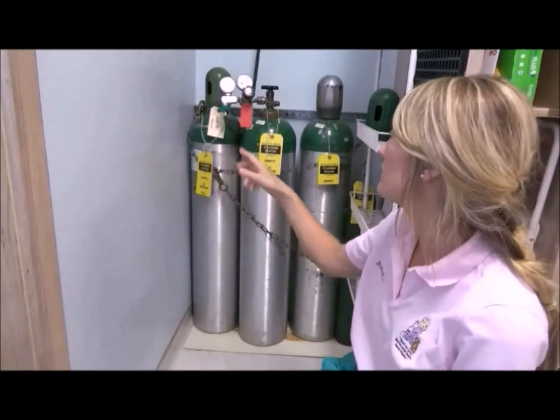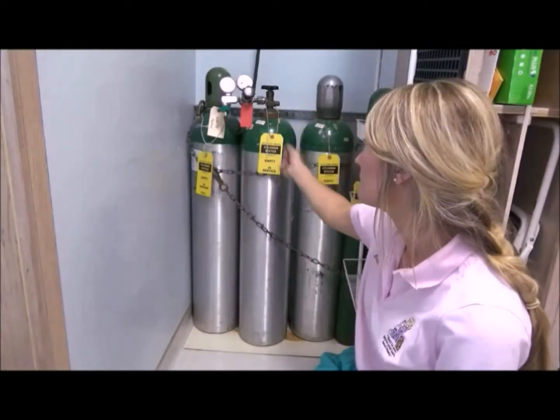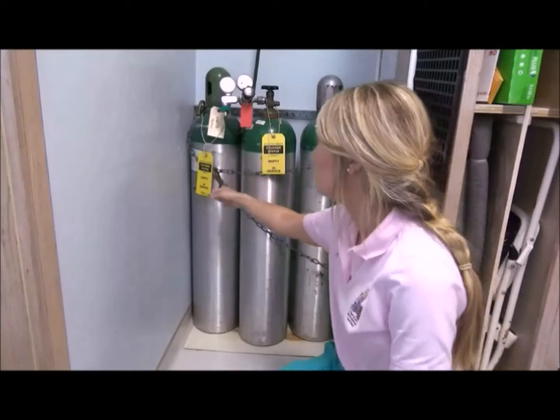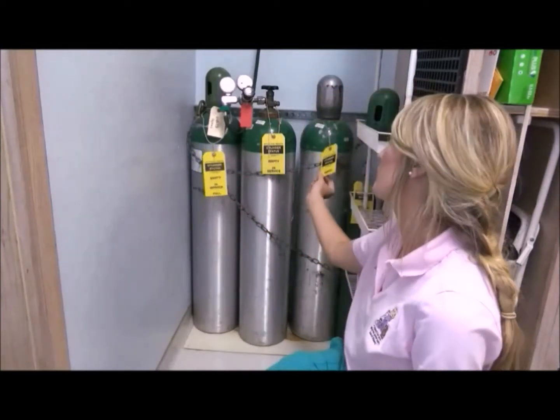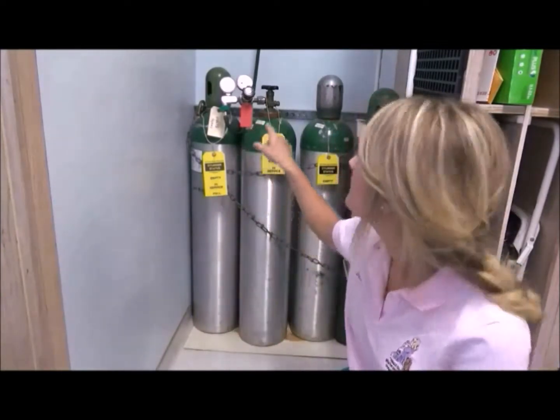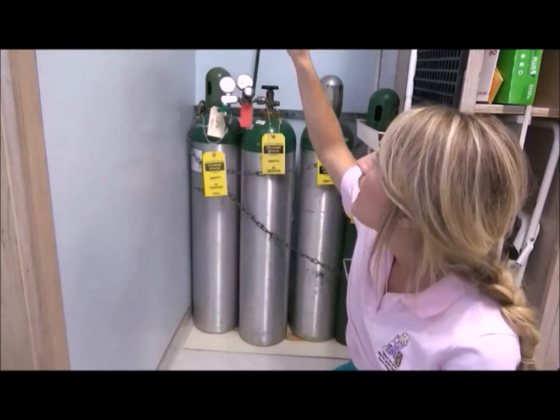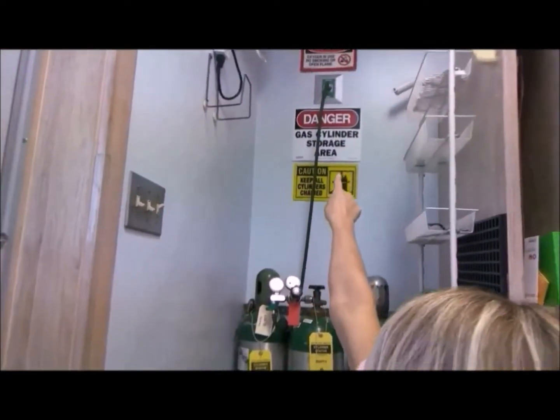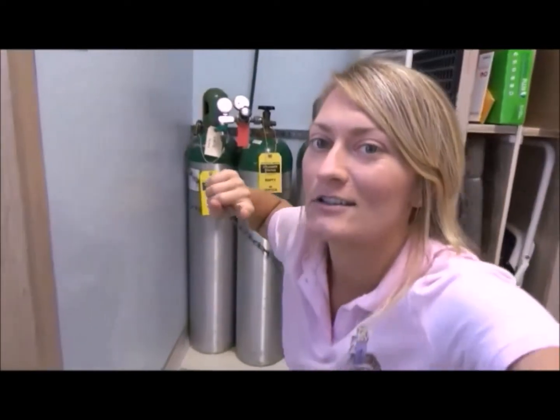We use H-size oxygen cylinders at our clinic. As you can see, they're securely chained to the wall. And then we note with these tags which one is in service, and if it's full, which this one is, or if it's empty, which this one is. We just keep track of that. And then how it works is the oxygen lines here, they actually run through the walls and the ceiling of the building, and then we have various wall connectors throughout the hospital that connect to the oxygen lines.